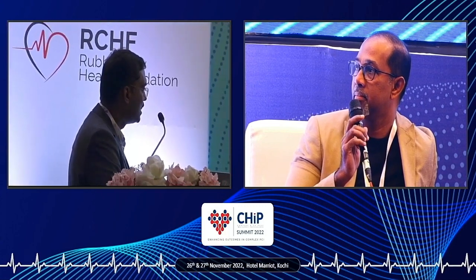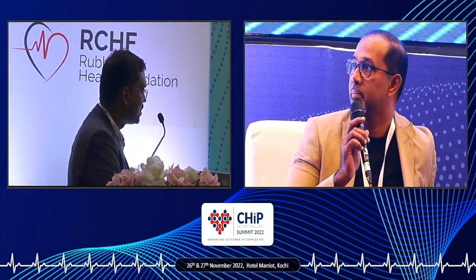As you rightly told, if it is within the stent, we can go straight away to 60, 80, because we are safe. And if we are dealing with the native vessel, I always go with 25. It depends on the lesion morphology. Suppose there is a thrombus, the laser energy will be absorbed much into the thrombus, so we can go higher, but always start with the lower and then go up. Whereas if it is a fibrotic plaque, you can go with medium. For very severe calcium, obviously, high energy.